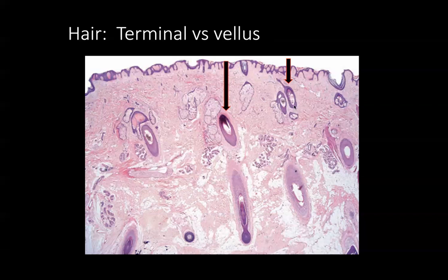which sit at the very top layer of the dermis. So they still have the hair. It's just transformed to this vellus hair instead of the terminal hair. And so, you've heard the term peach fuzz, like kids with peach fuzz on their face. It's just a lot of little vellus hairs that are on their skin. And we actually have vellus hairs throughout most of the skin of our entire body. It's just that it's very difficult to see them in most cases, but they produce thin white hairs.